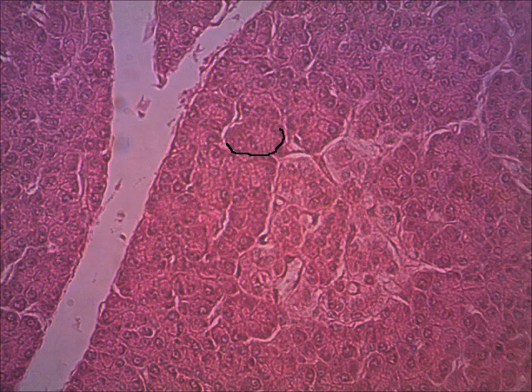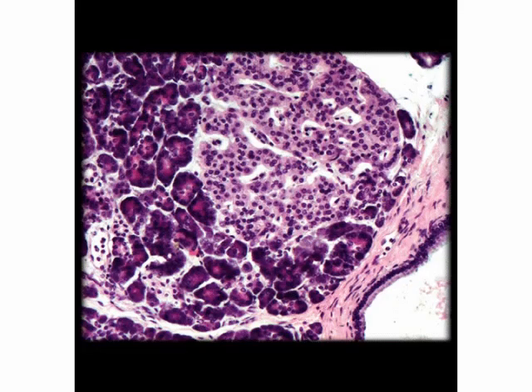These are the exocrine clusters. You don't have to name them. We'll study them when we get to the digestive system in lecture. But all those dark little clusters are the exocrine areas. The large cluster that I'll circle in green, this large cluster, that's the pancreatic islet, okay? Which I know on this view doesn't stand out as much as on some views.